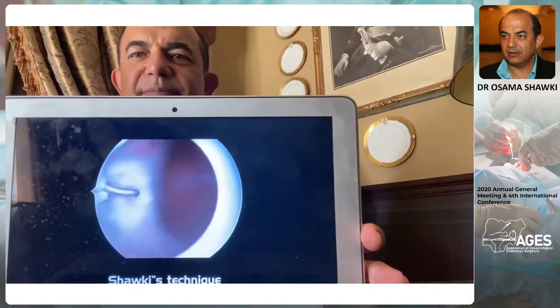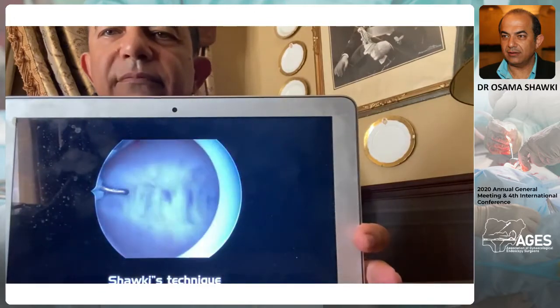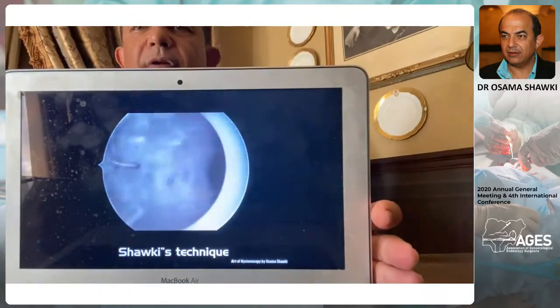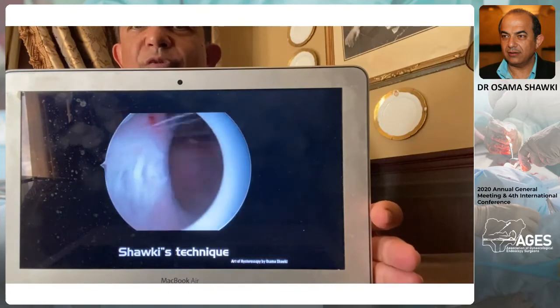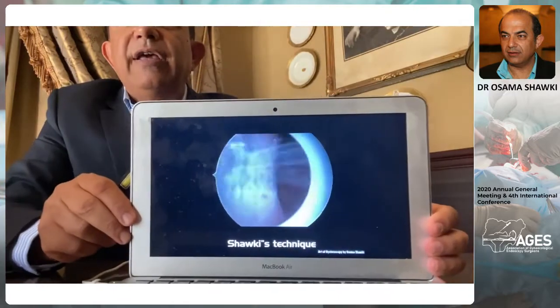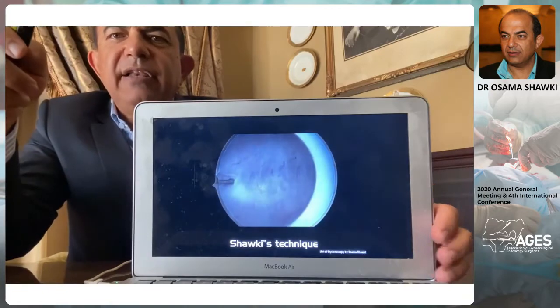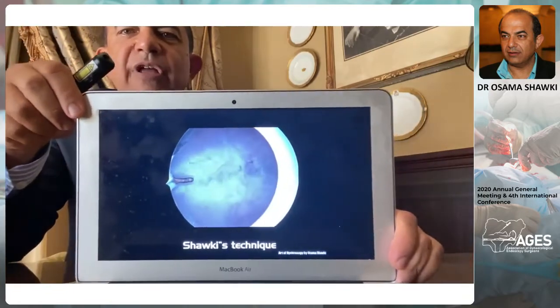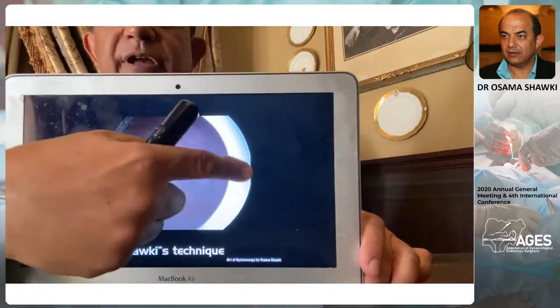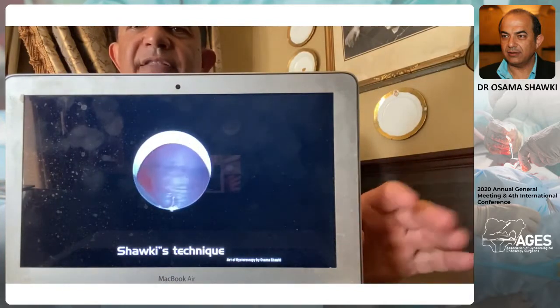That's a very broad septum. Moving from side to side. Moving from side to side, keeping the ostium as your landmark. Okay, the tubal ostium should be your landmark to know the direction of the electrode until you reach the fundus, and you can check my video, I'm always looking and checking the tubal ostium, because this is my landmark to know when to stop. And then you decide this is the end of the procedure.